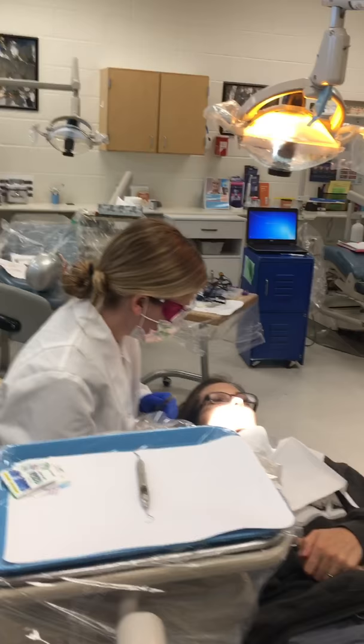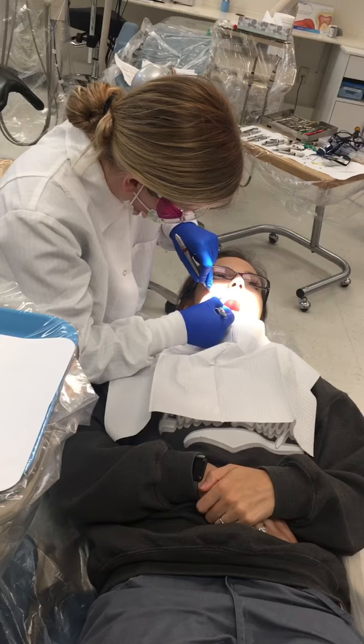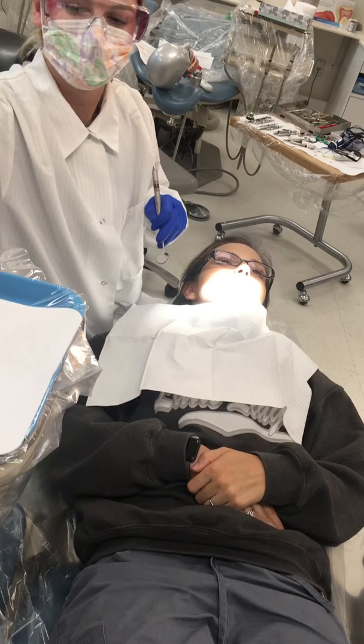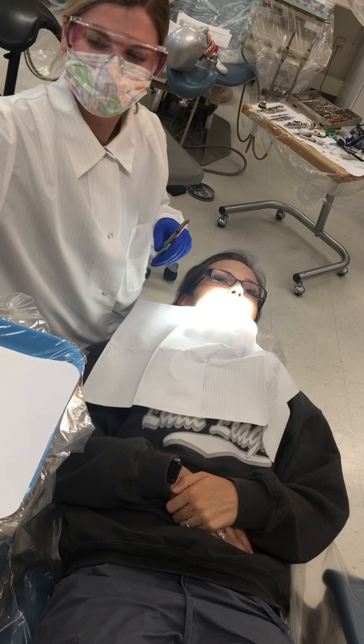Now that you're numb, I'm going to go in and go below the gum line where we talked about that six millimeter pocket and scale off where that calculus is. Is that feeling okay?